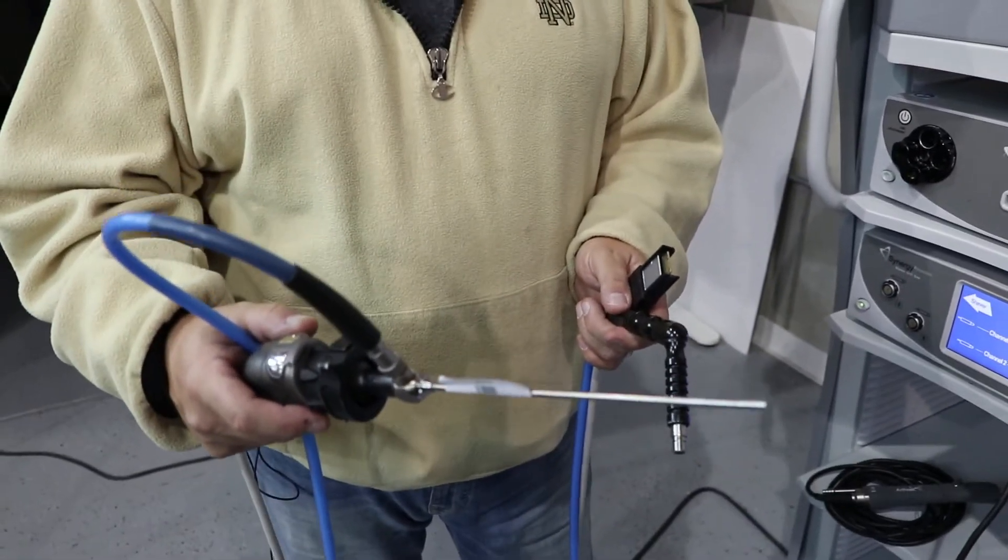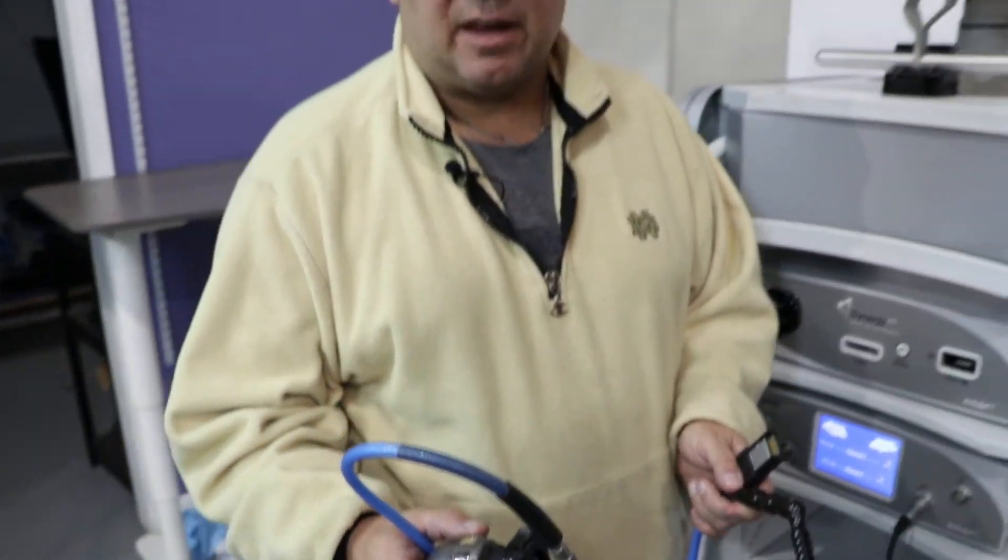The Synergy HD3 system consists of a camera head, a light cable, and a scope. For the purposes of this demonstration, we've chosen a four millimeter 30 degree Arthrex scope.